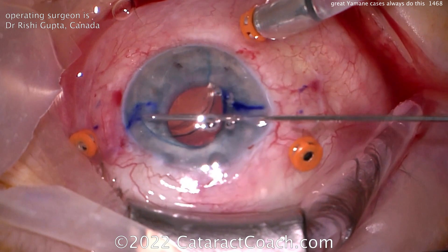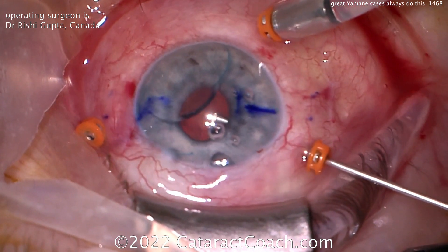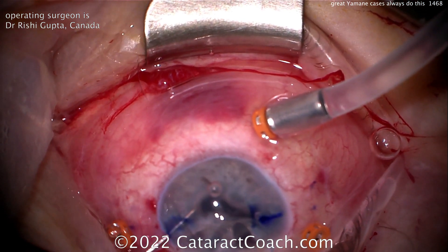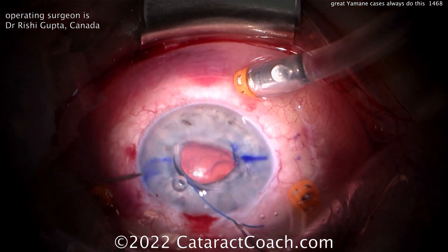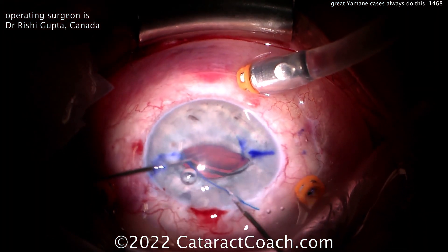The trick for a great Yamane procedure is a complete pars plana vitrectomy — that's it. Look at the three ports on the eye: the pars plana ports. That's the secret to the procedure. Here's why — watch what happens. Put the lens in the eye.